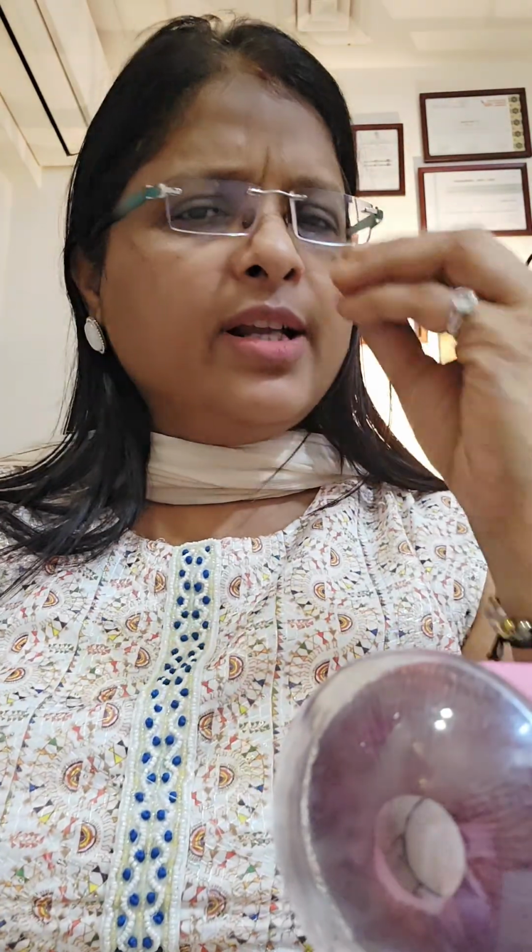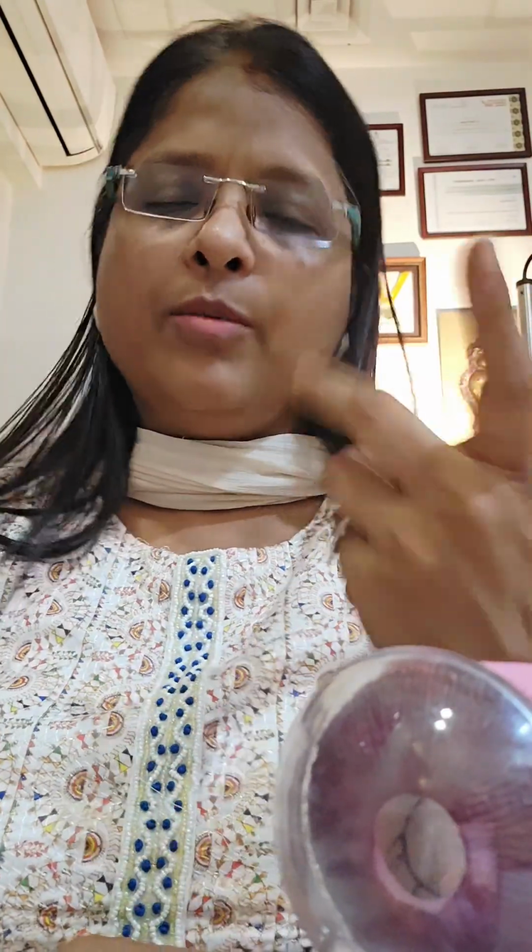And there's a very small number of people. If we implant multifocal lenses in 100 people, hardly one or two may complain of such photic phenomenon, optical phenomenon, and that they can get rid of. In a very small number of people, this may linger.